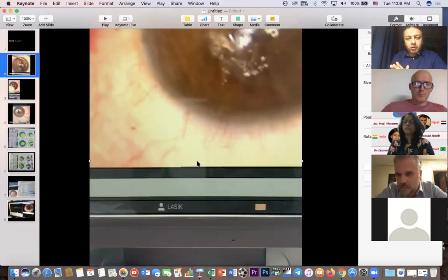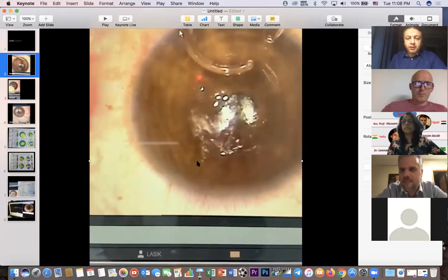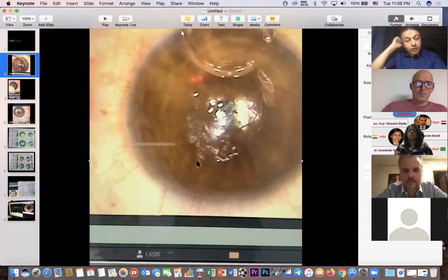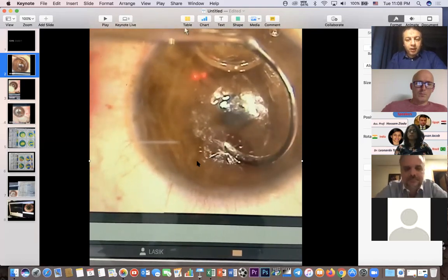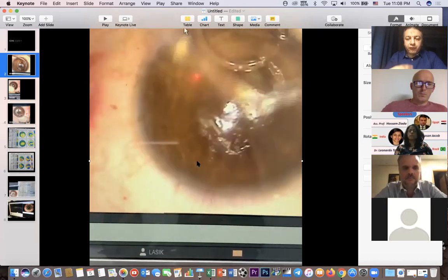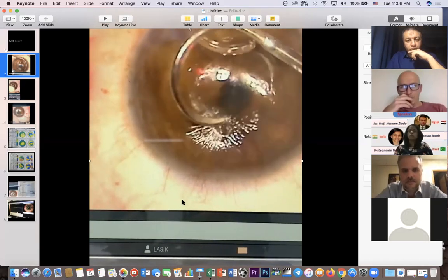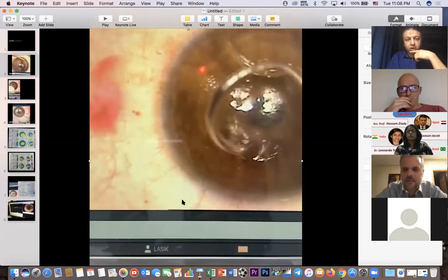But I have tried all of that. First, I dilated it again manually after the femto laser and put it in. And brought the ring and tried to push it, but no way. So I'm going again to dilate and make the tunnel wider and smoother. But I will go further this time. I will try to fasten the video. I'm trying to get to the other side, but it was blocked.